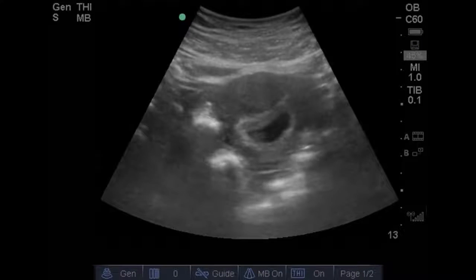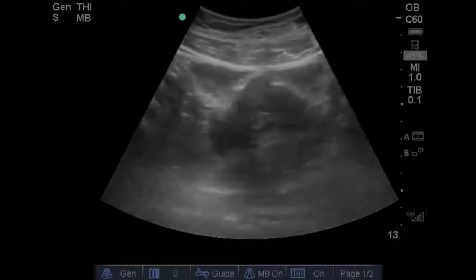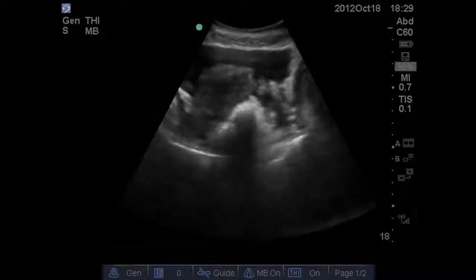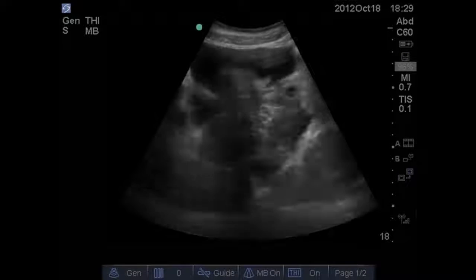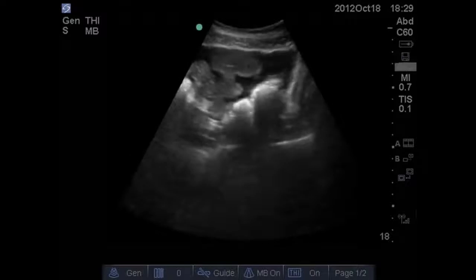And once again, if you identify intrauterine pregnancy, return to it to evaluate it further if need be, but however, do not get distracted by it and forget to complete your scan. Here you can see the rhomboid-shaped bladder, and as we scan through, we note a large amount of free fluid, anechoic, sharp angles surrounding the uterus in both the anterior and posterior cul-de-sac.